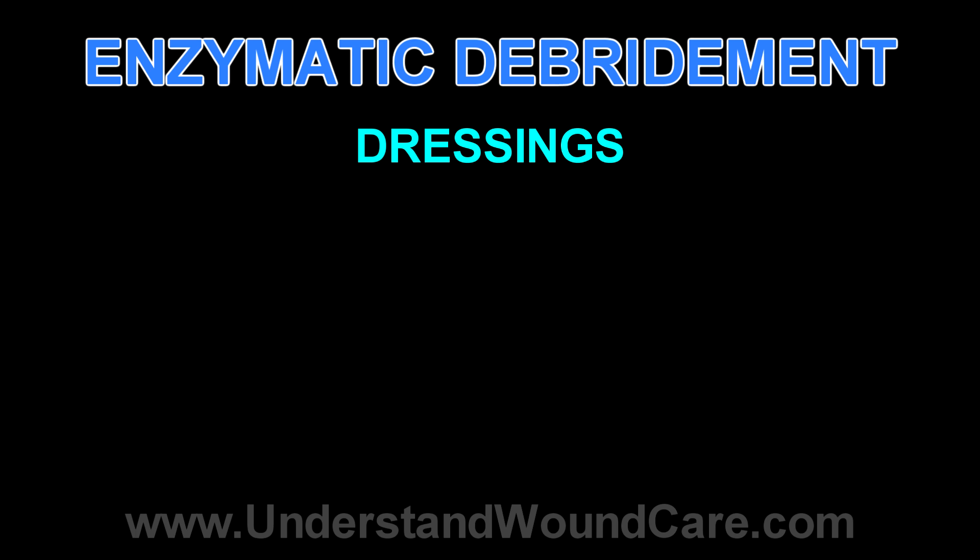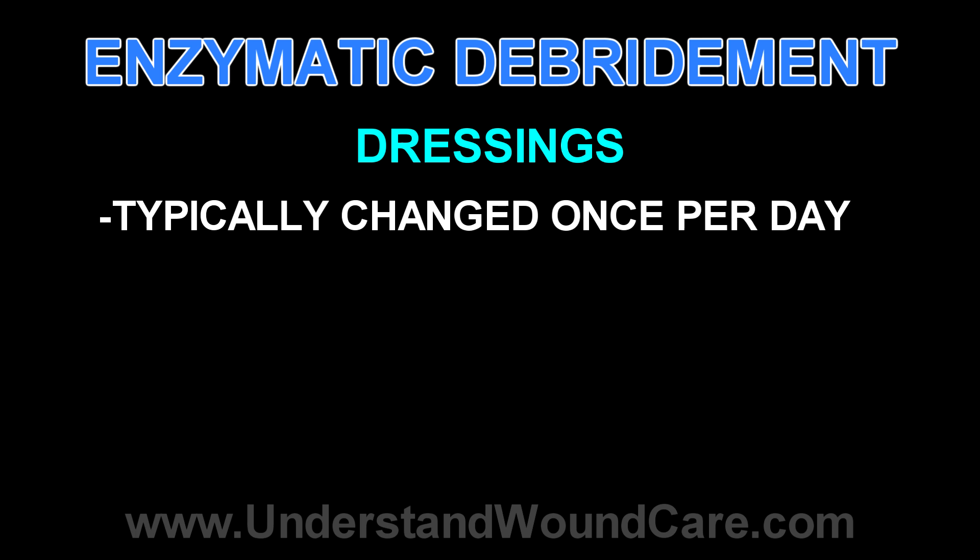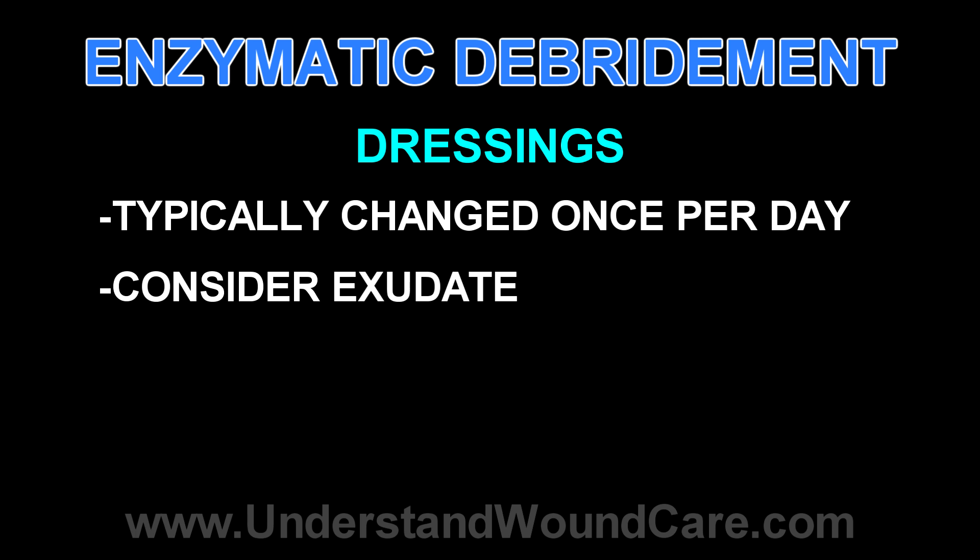After the dressing is applied, generally enzymatic debriders are changed once every day. If, however, the wound is highly secretive, you may increase the frequency so that you don't incur maceration on the peri-wound surface. It's not common to decrease the frequency much from Q24 hours.